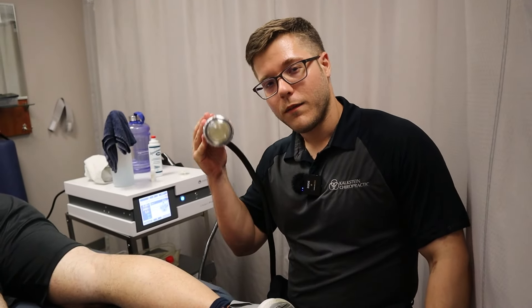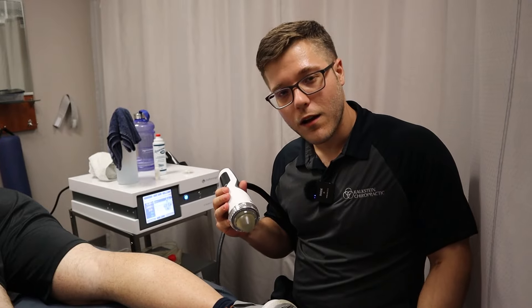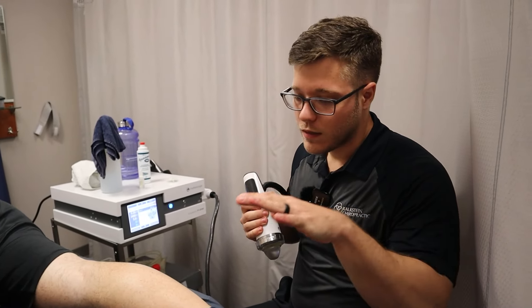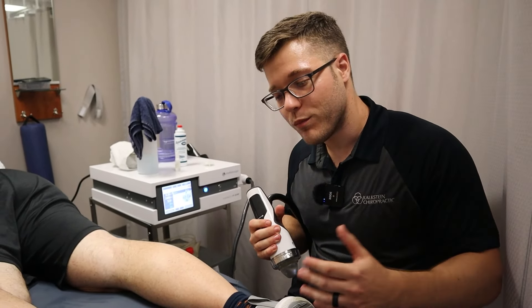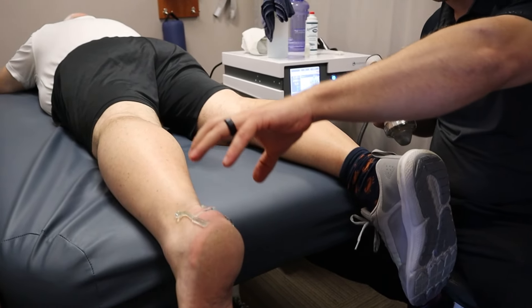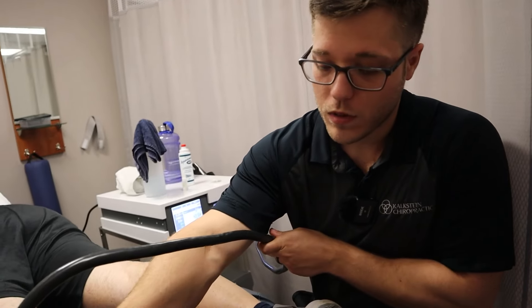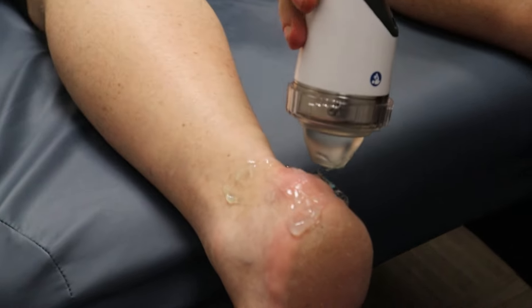Hey everybody, this is Mike. Got the Focus Shockwave back at it with another video from Kalkstein Chiropractic, your local Towson Baltimore area chiropractor. Today we've got a patient who is experiencing Achilles heel pain, so we're going to be focusing right there on the sweet spot today.